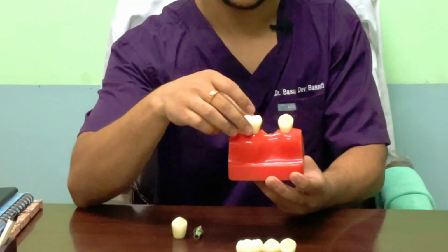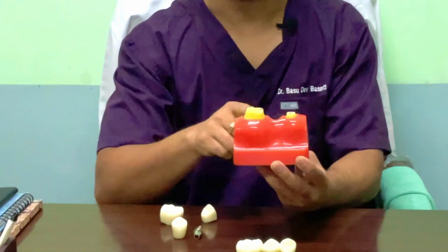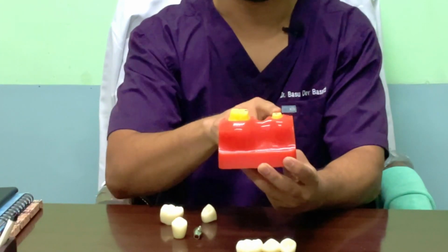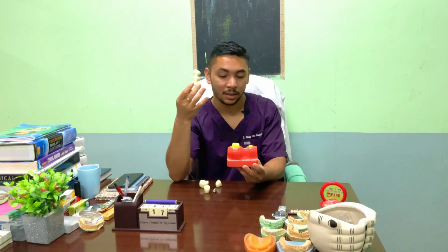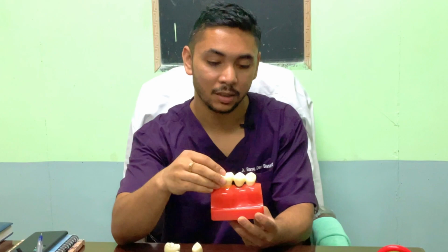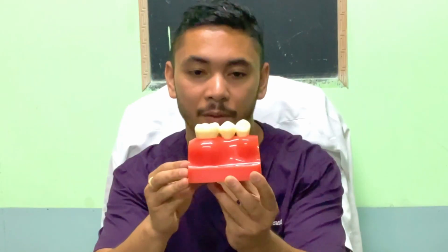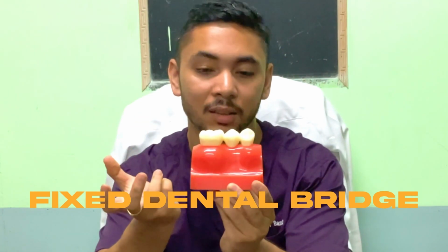So when we do that, this is what we get after reducing the tooth. Now the two adjacent teeth are reduced, and we can prepare this nicely, take the impressions, and then fabricate a new prosthesis which will be a fixed dental bridge, and then we can cement it in this way and you will have a fixed dental bridge. This way we can replace a missing tooth.